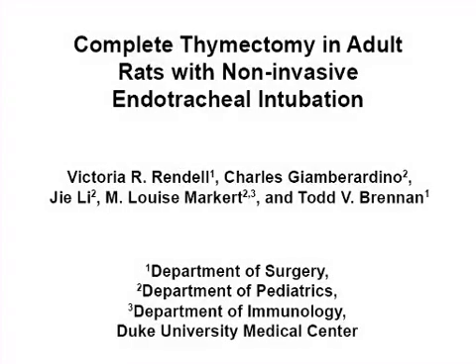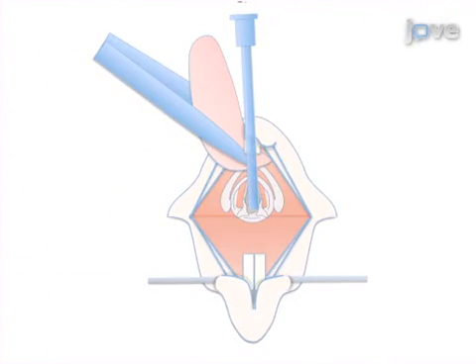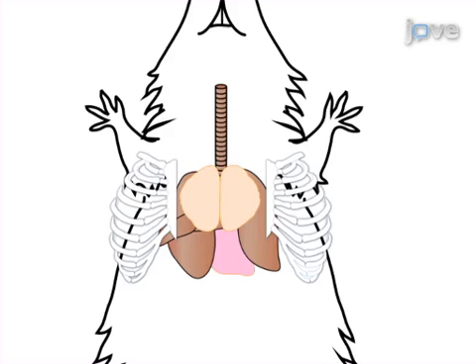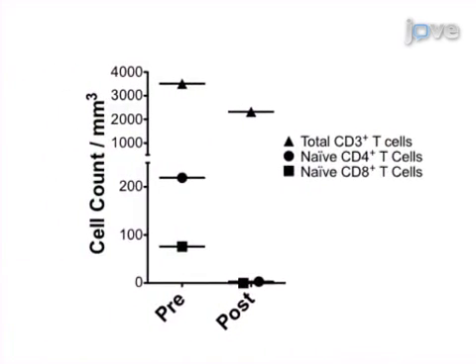The overall goal of this procedure is to evaluate T-cell function in the absence of the thymus. This is accomplished by first intubating the rat and then opening the chest to expose the thymus. Next, the thymus is dissected from the surrounding tissues and hemostasis is obtained. In the final step, the incision is closed in layers. Ultimately, the peripheral blood mononuclear cell population can be evaluated by flow cytometric analysis for the presence of naive T-cells in the absence of thymus function.